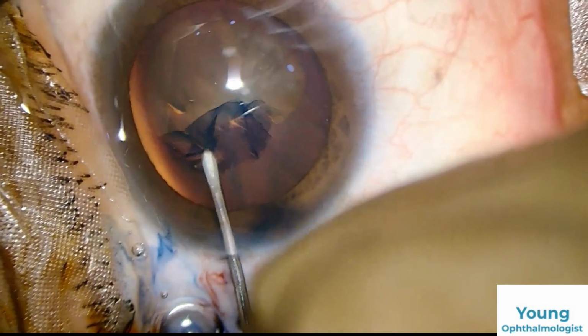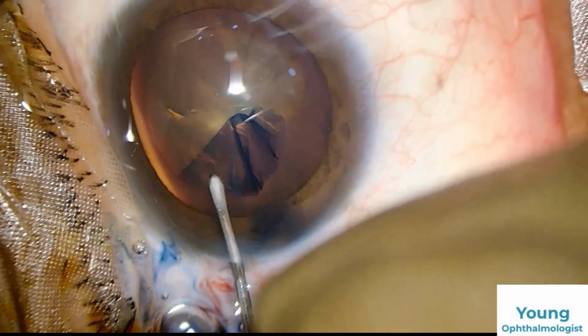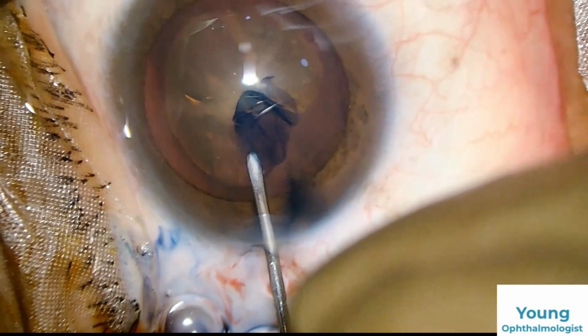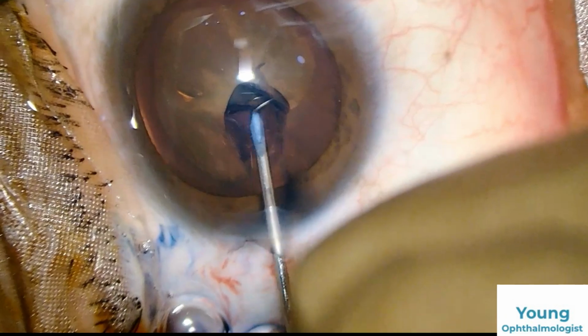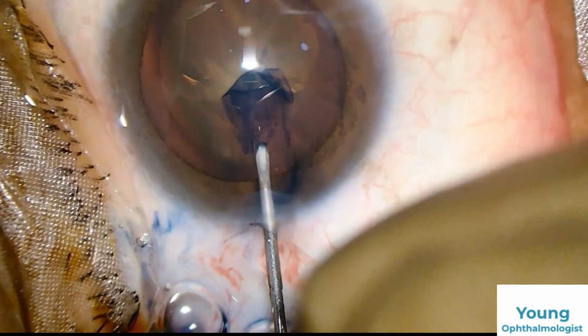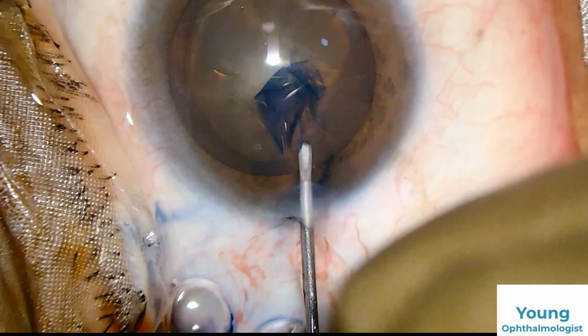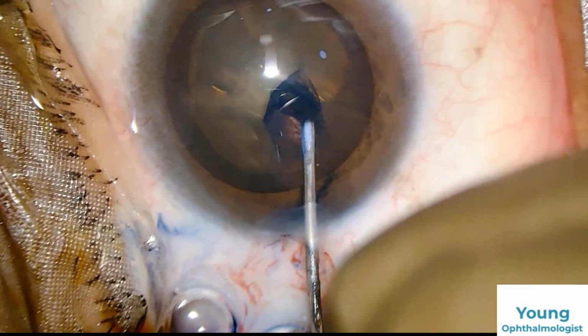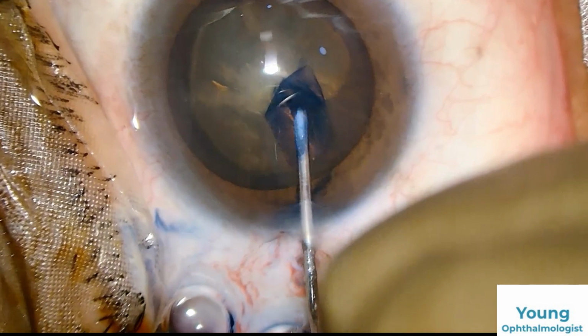In topical cases, you should always use a screw speculum. A wire speculum is not very good for stabilization of the eye and lid pressure handling, but you should take care that the screw speculum should not be very tight, because that will also lead to lid stretching and pain for the patients.